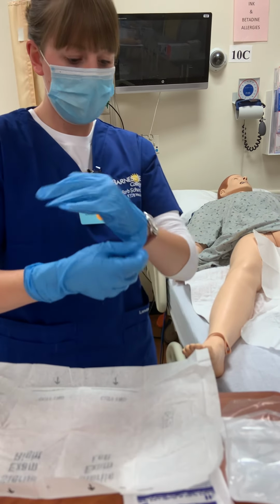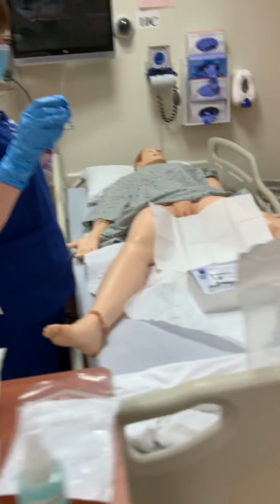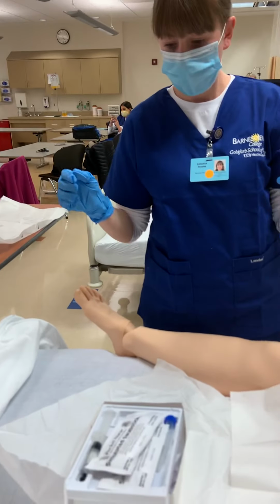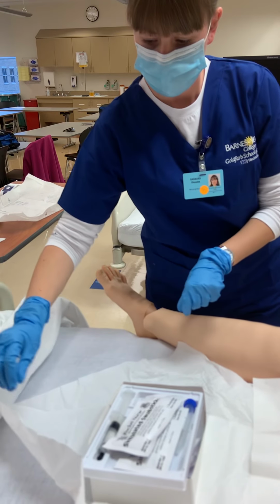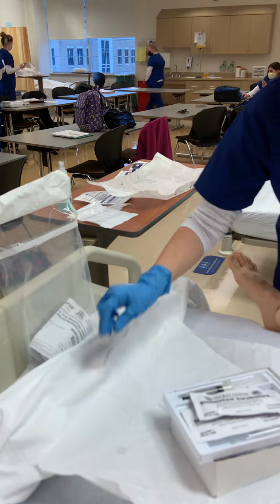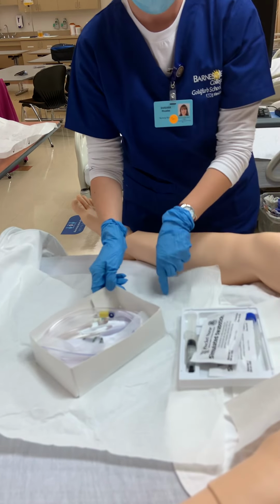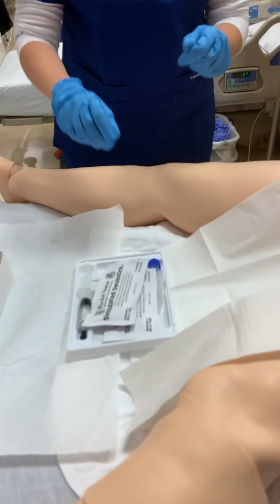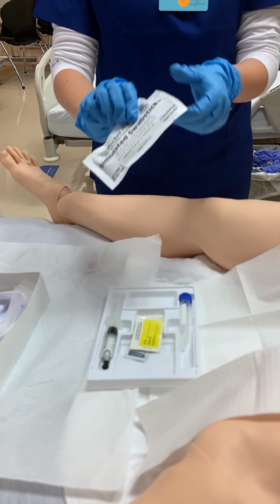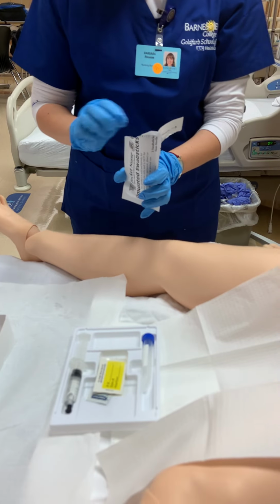Okay, so now I have all my sterile gloves. Okay. So now I am going to clean this just a little bit. These are extras. So I'm going to open up my swabs here that I'll be using for cleaning, and I'm going to set those out on the tray.